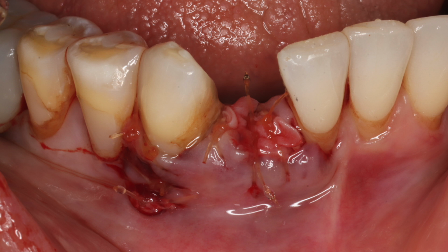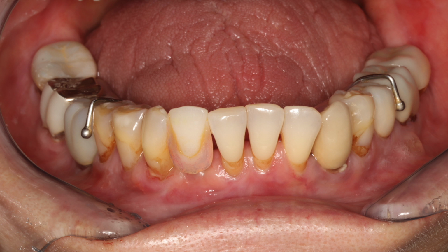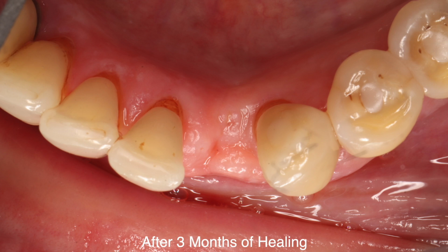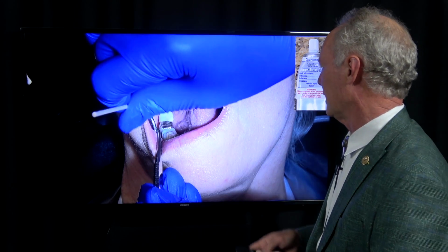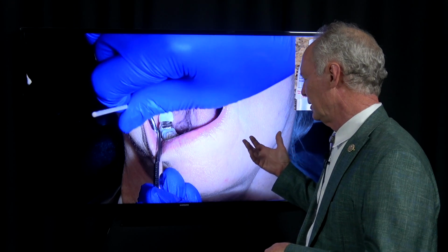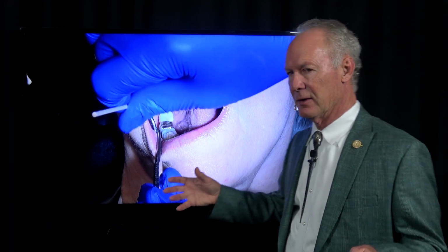Okay, so you can see the graft. This is a provisional flipper. This is after 3 months of healing. So we've got adequate facial lingual bone, but not enough for a root form implant. So it's all about surface area. So you either want a wider implant, larger diameter implant, or a longer implant.